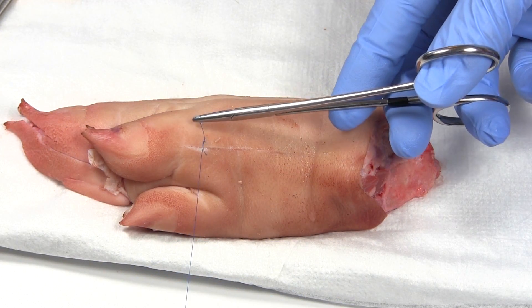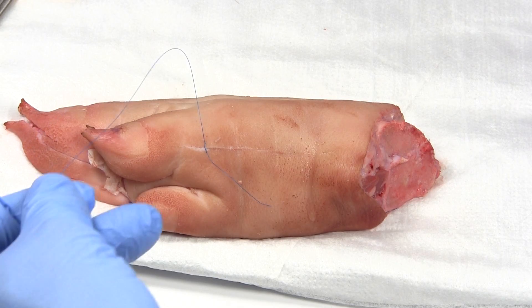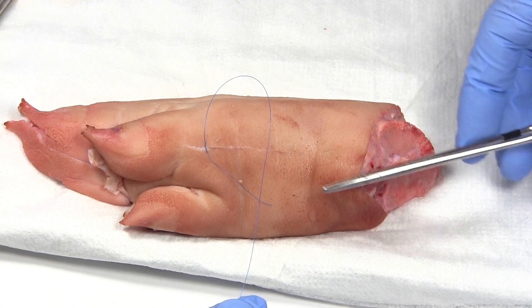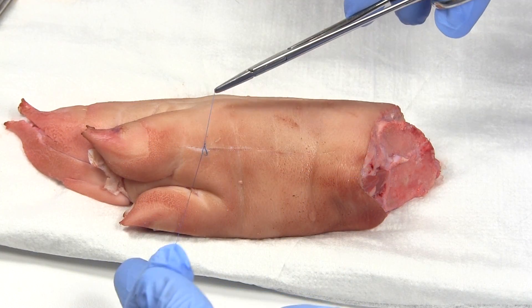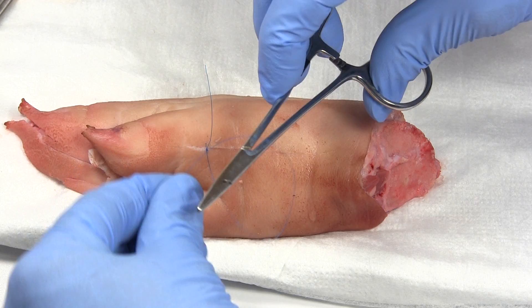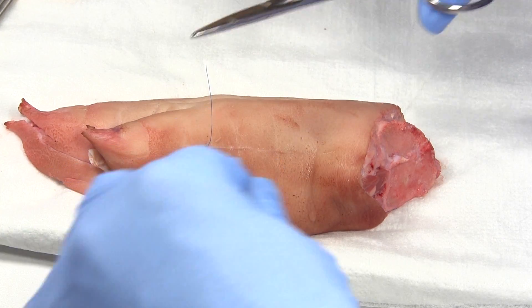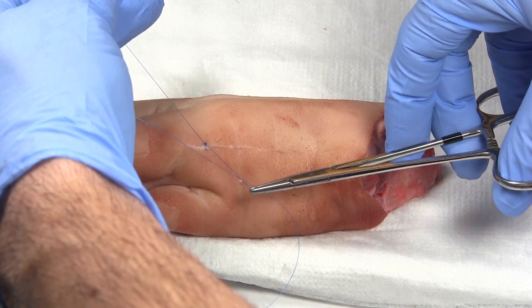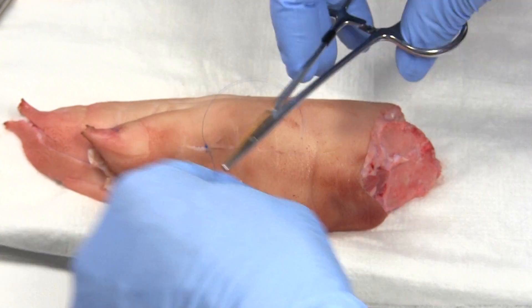So there's the first knot — two throws. Then the second time, go one throw: one wrap around and pull through. Each time you do a knot, go in the opposite direction. If the first time you went around from the left side of the needle driver, the second time go around from the right side. Alternate like this, and do that about four or five times.